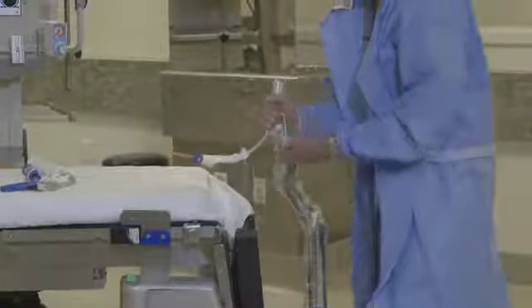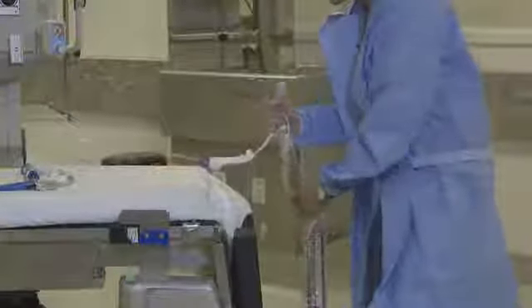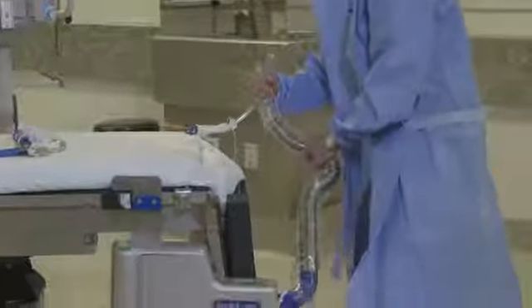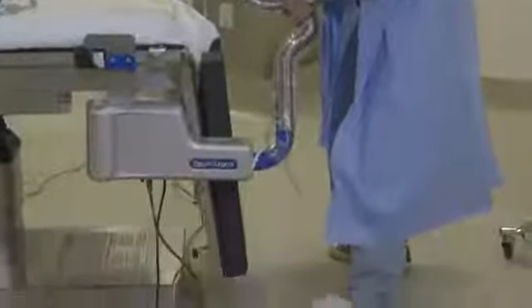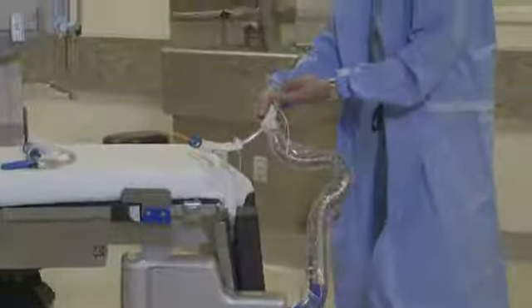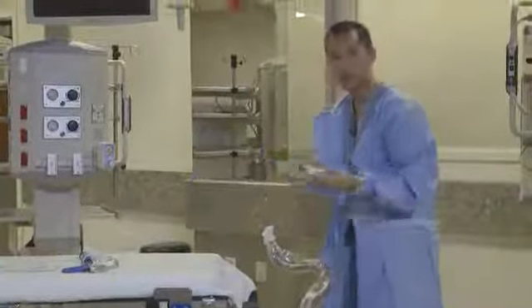So as you can see here, I've got one hand securely on the manipulator, but I can also adjust. And again, my foot is on the pedal so that it allows me to create the different angles that I need. And then once I have an angle that I want, I'm going to hold it, let go of the foot pedal, and it's going to lock it in place, right? And of course, to remove it, very simple. You're going to pop the clamp, and the device comes out.